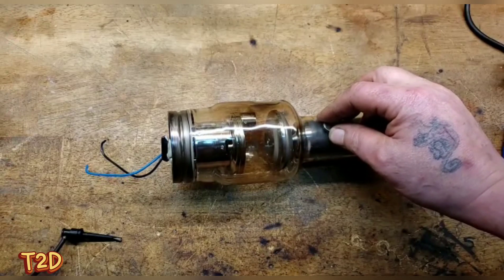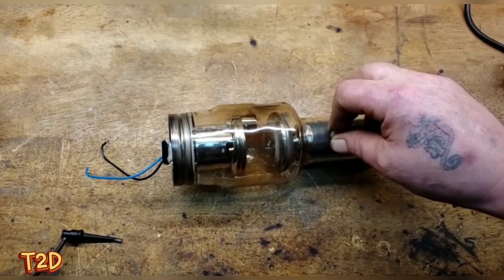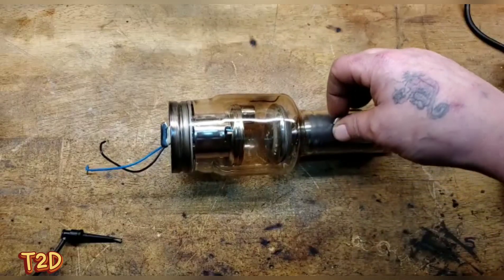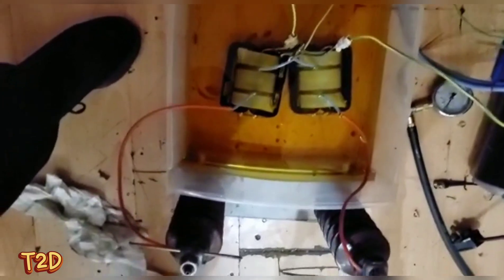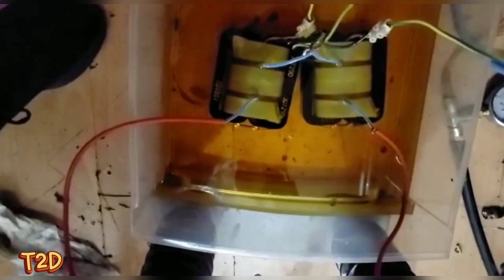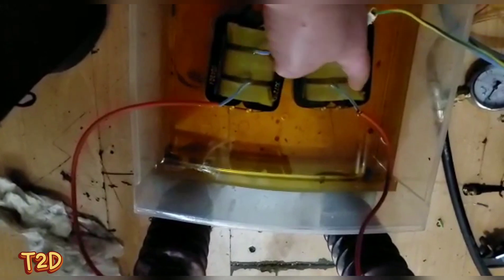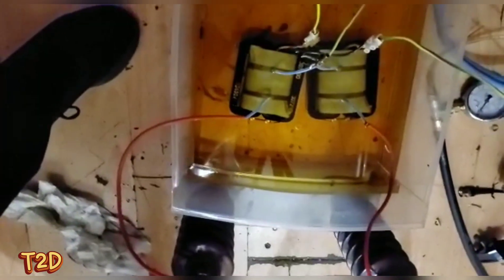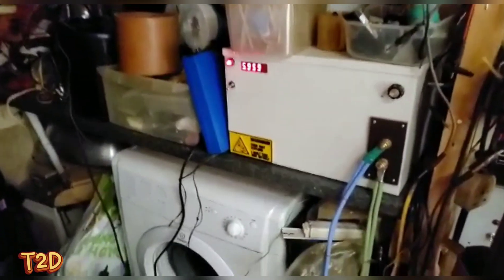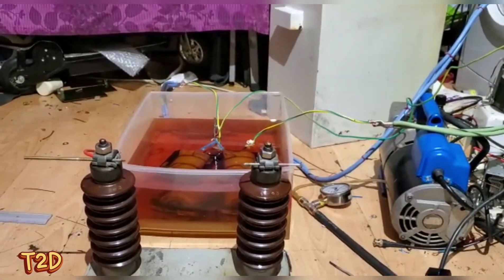Now we'll look at the transformers that drove this thing. The secondaries are tied in series with the midpoint grounded, and the primaries are connected in parallel but in anti-phase, so they work together to give a high-voltage output from each side. I'm not rewiring the voltage doublers, but we can test the transformers themselves. We're powering them from a half-bridge running at about 6 kHz, and we've opened the arc gap to 17 centimetres - we'll see if we can get it to strike.